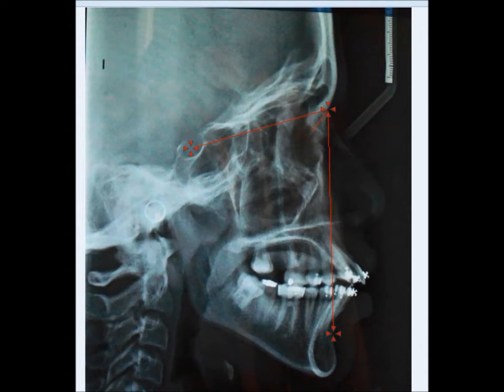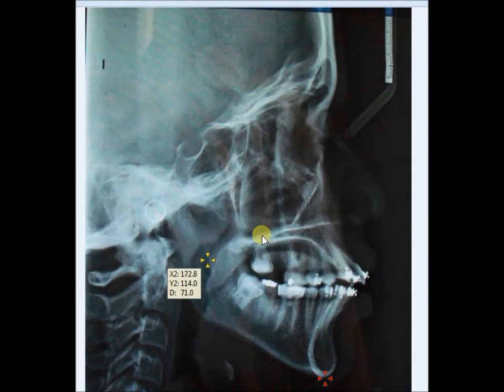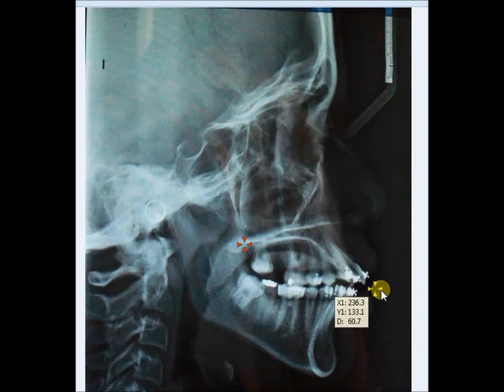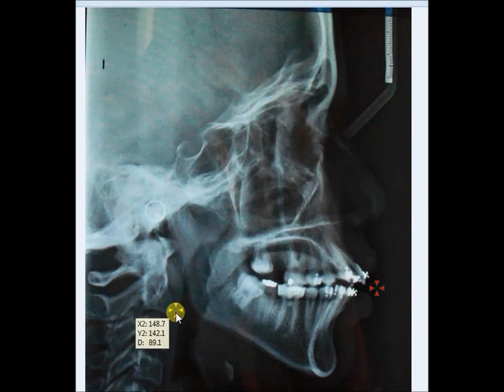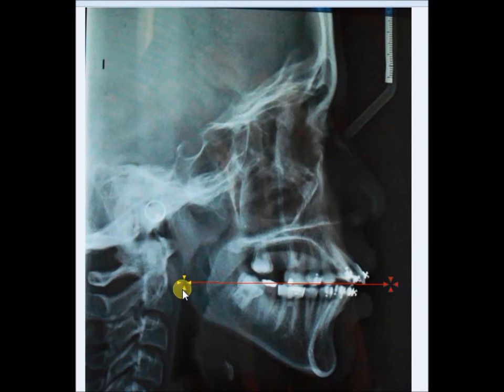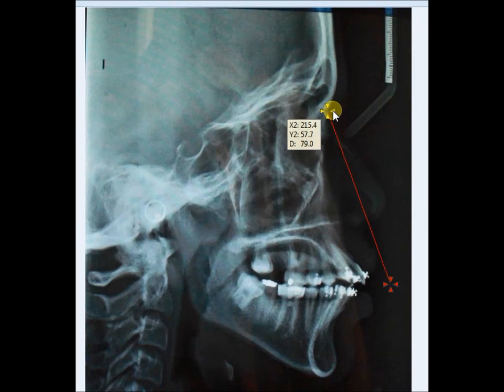Now I'll show you how you can draw a line or a plane. Left-click and drag — yellow — left-click and drag. Here I'm showing you the occlusal plane. The occlusal plane is a line connecting the occlusal of the upper first molar to the incisal edges of the upper central incisors. Here is the occlusal plane.